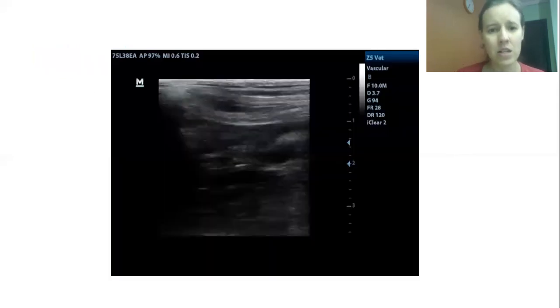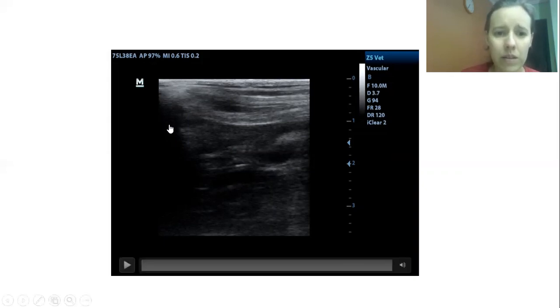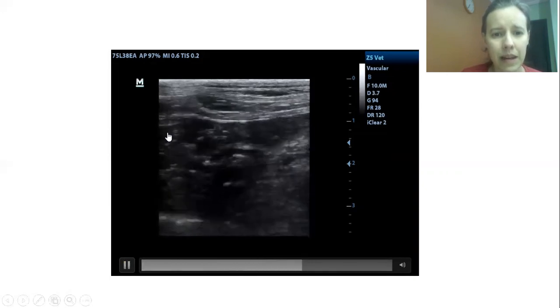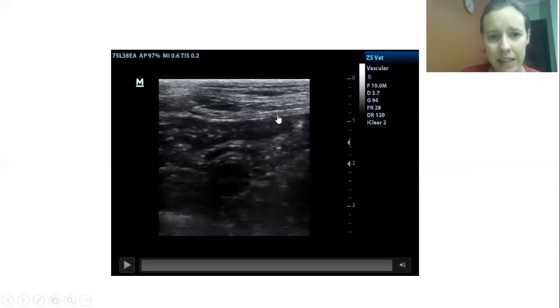The right lobe is the largest in the dog and runs caudally, parallel to the duodenum. In this image, a linear transducer at 10 MHz was used with the dog in dorsal recumbency and the transducer on the right side wall. With higher frequency linear transducers, it becomes a little easier to find the pancreas, as seen here.